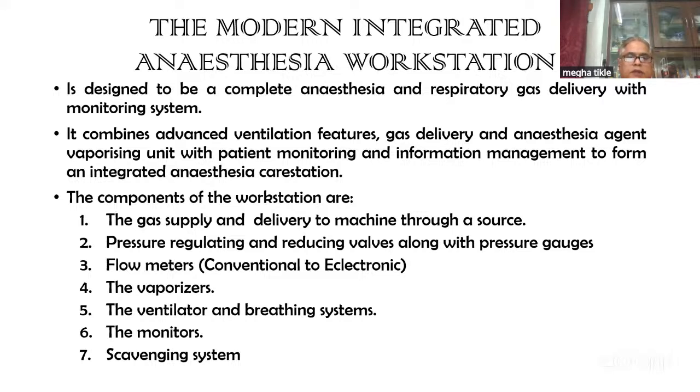The ventilator and the breathing system we have developed from a pressure-driven system to a volume delivery system to a combination of both flow and pressure-generating system. The monitors and the scavenging system has been recently introduced, and the monitors right now include from the basic standard monitors that are required by ISA or ASA and to the advanced monitoring system that is required for attending to any critically morbid patient or a very young patient. So everything can be used in this machine.